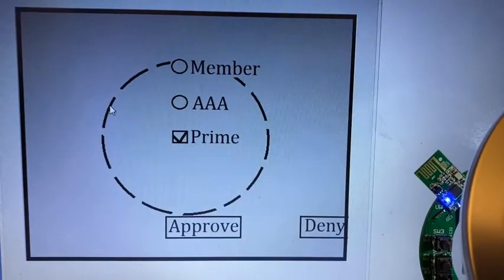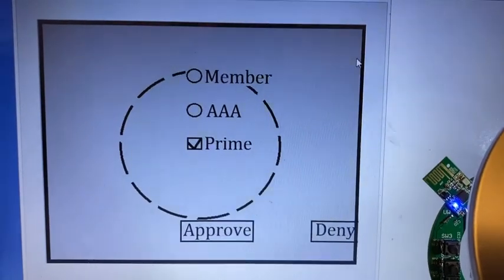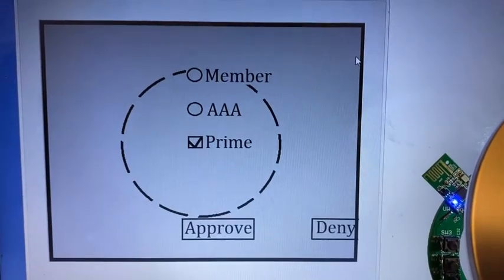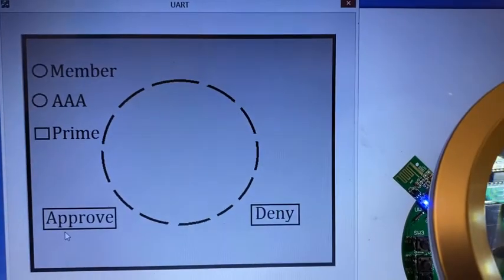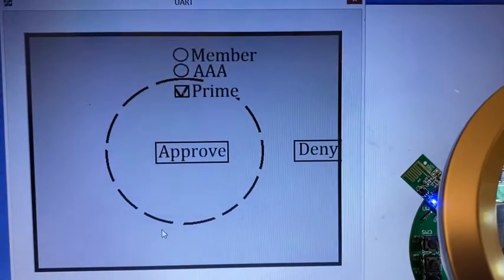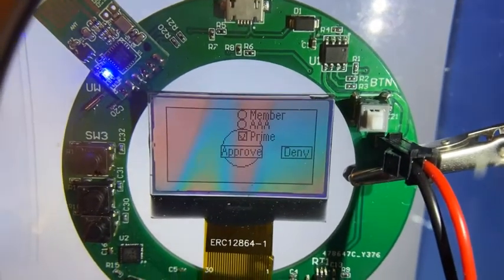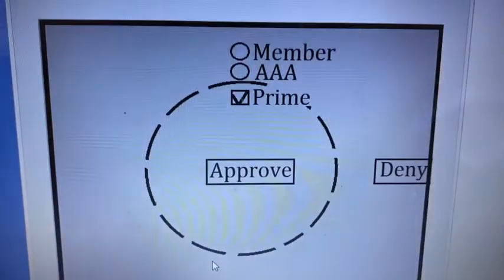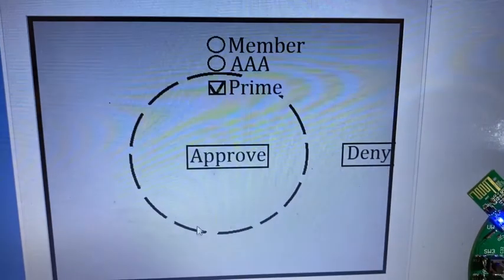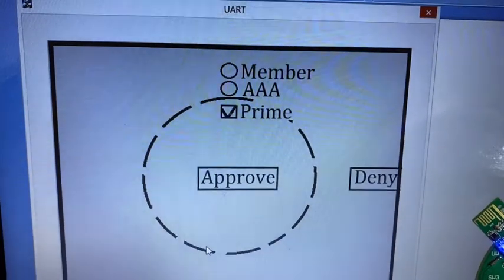Again, the user will use his eye as a pointing device, will lower his eyes to focus on the approve button, and at that point the image will shift so that the approve button is actually at the middle of the display, and with an additional triggering action, the approve button will get triggered, an event will be generated, and the system will process it appropriately.